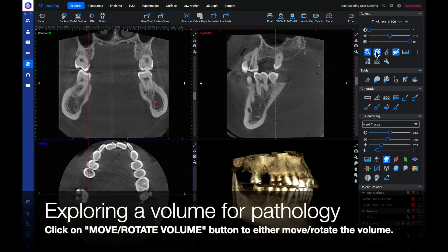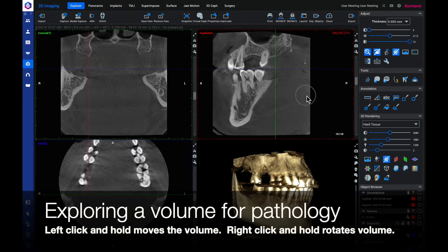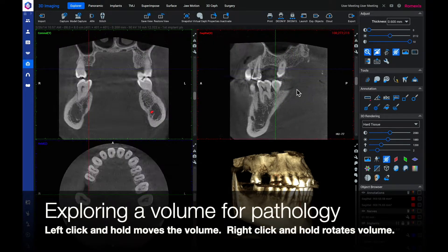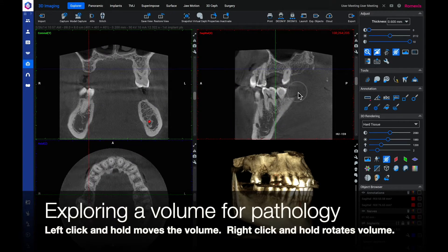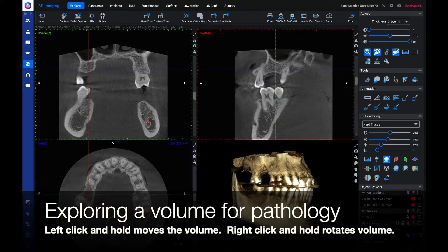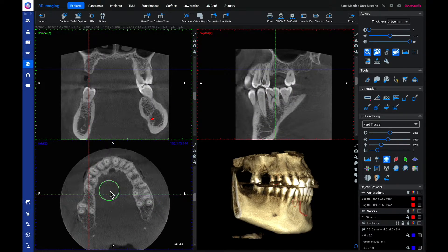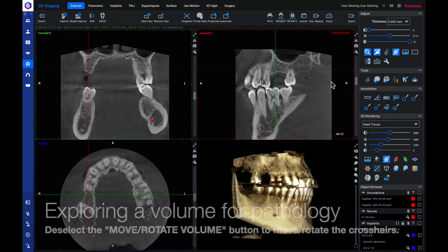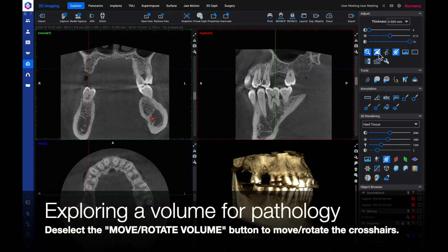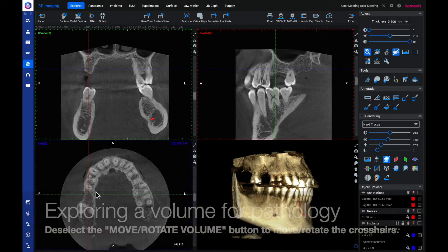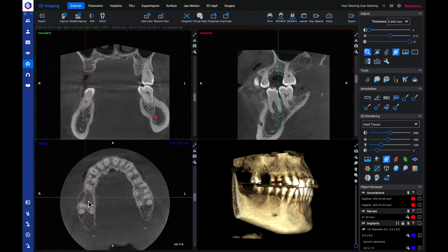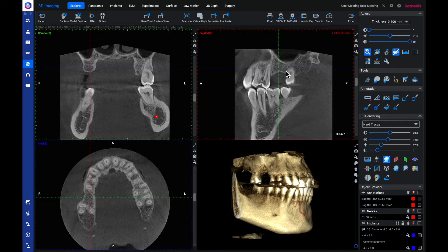Click on Move/Rotate Volume to either move or rotate the volume. Left click and hold moves the volume. Right click and hold rotates the volume. Deselect the Move/Rotate Volume button to move and rotate the crosshairs instead. Left click moves the crosshairs; right click rotates them.